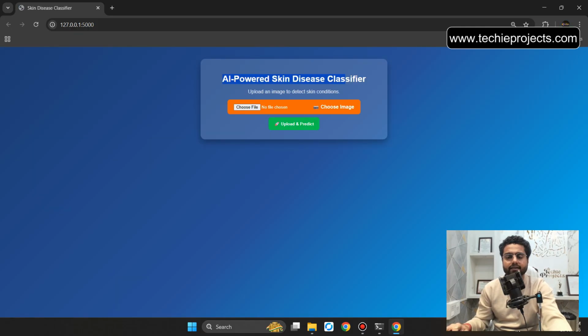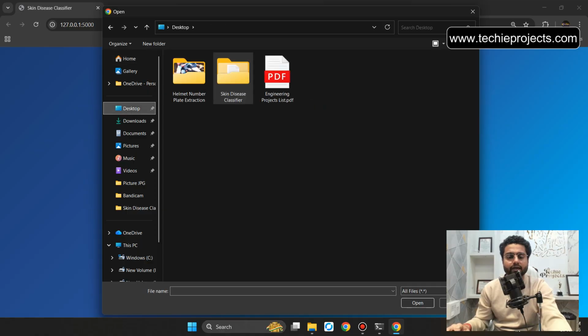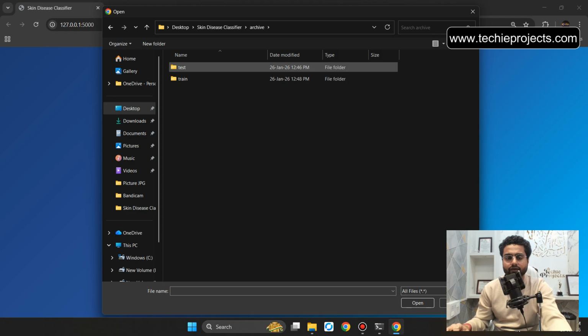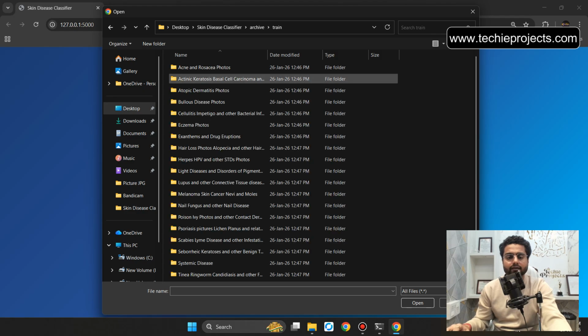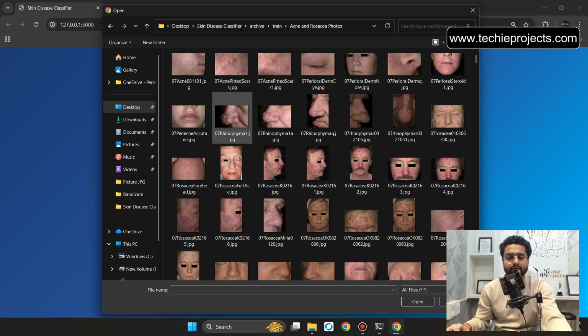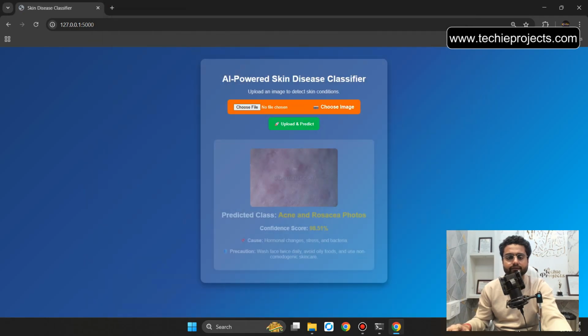AI powered skin disease classifier. We have to upload an image to detect the skin conditions. So let's click on choose file. So we have to choose from that particular data set. Let's double click on the skin disease and it will be dataset folder. Pick it from the training or testing folder. Let's select this folder and select this image. Then click on upload and predict.